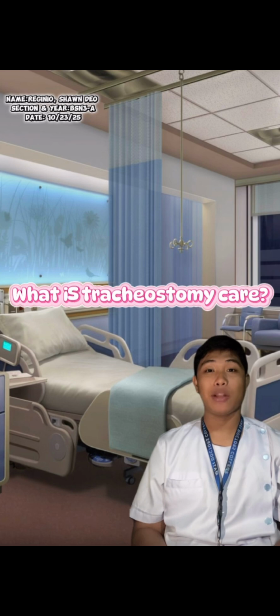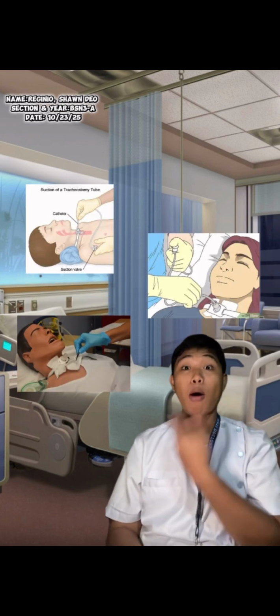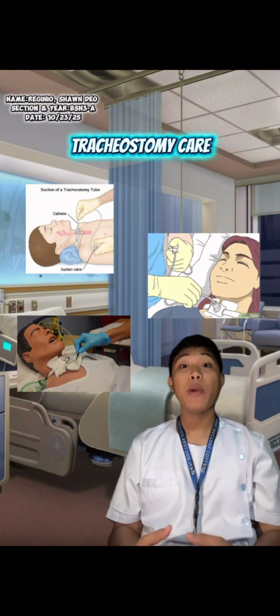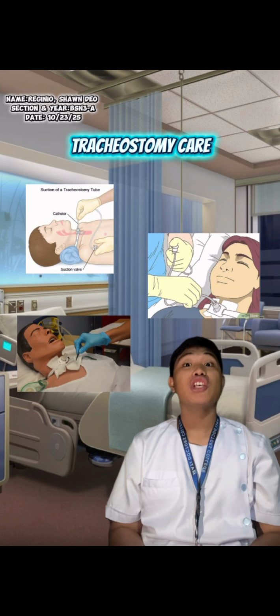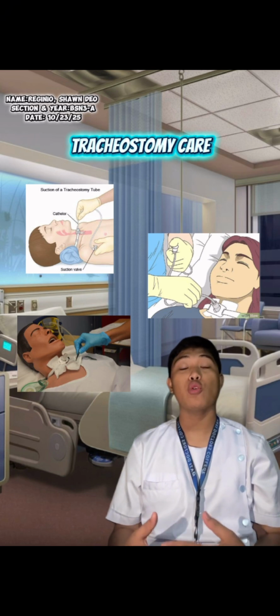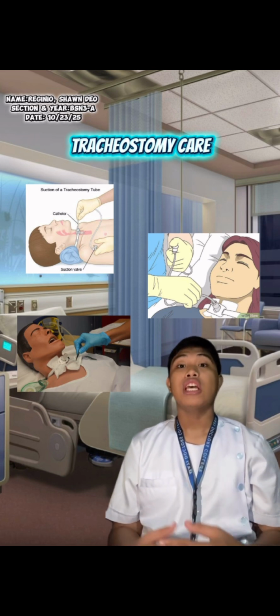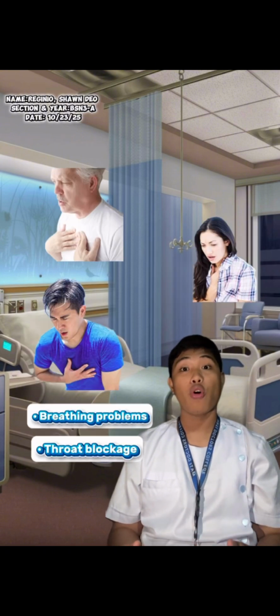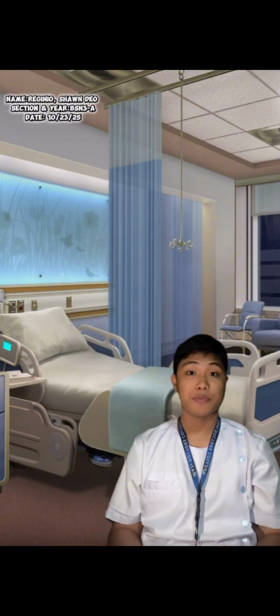Today I will talk about tracheostomy care. A tracheostomy is a small opening made in the neck that connects directly to the windpipe, or trachea. A tube is placed in that opening to help the person breathe. It's usually done for patients who have breathing problems or throat blockage.